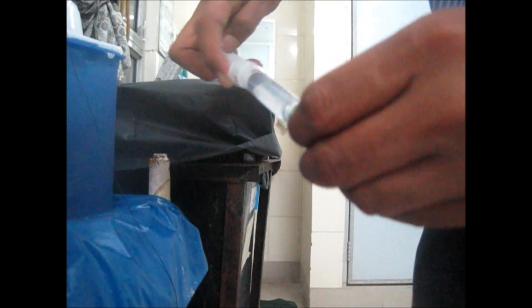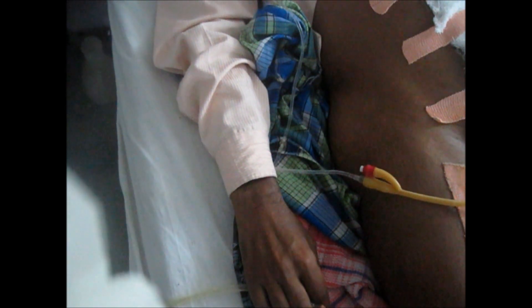Fill the vial and after that mix it in the normal saline. We will attach it to the outlet of the catheter where the urobag is attached, and we will allow the fluid to flow with gravity — we will not push the flow. Allow it to go on its own with gravity, leave it there for two minutes, and after that remove it.